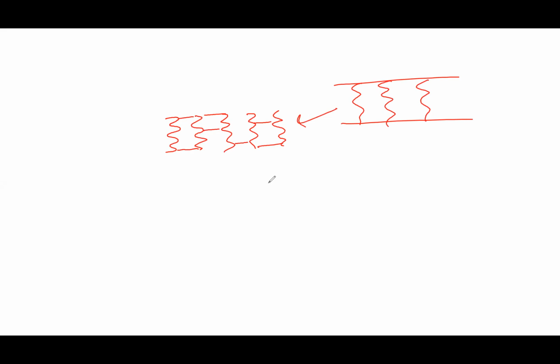If you look at a strut, this is the strut, and you make a cross section of that. So this strut is metal, and it's made up of chromium, cobalt, or platinum, something like that, some kind of inert metal that does not cause inflammation in the body. Then we put a polymer on top of it.